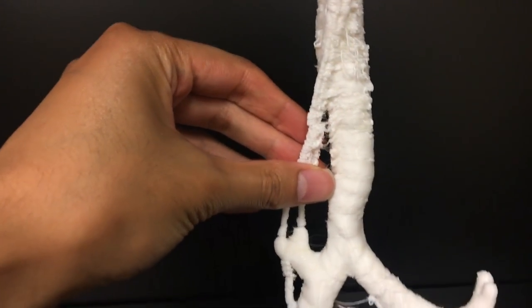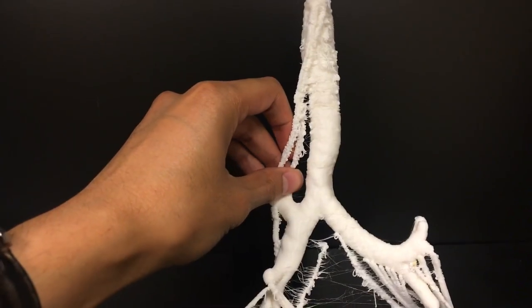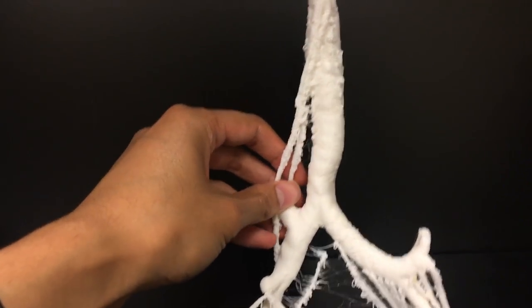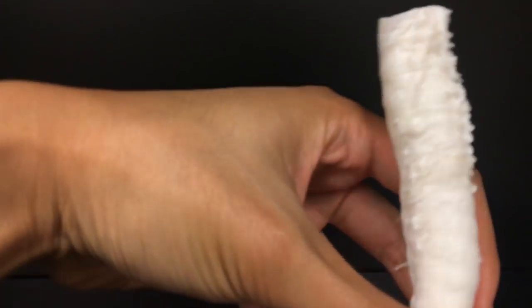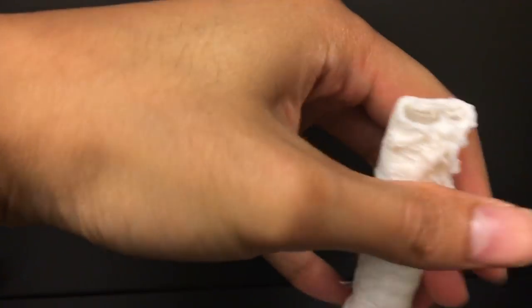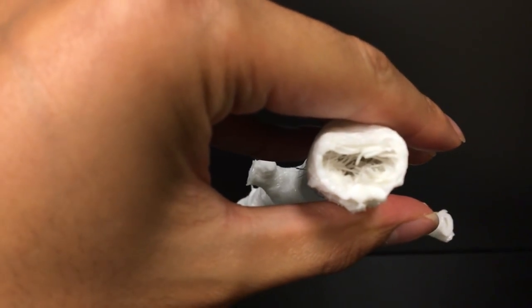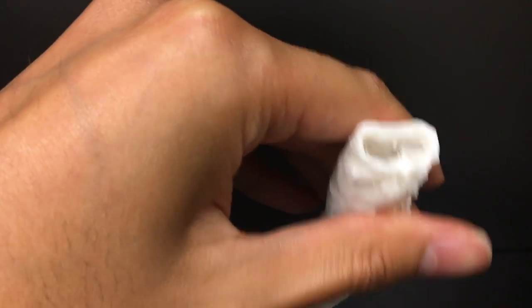So the next step would be to clean up the model, basically. Just take off your supports. And once you do that, it looks like this. There it is, fully cleaned. So again, the geometry up here, not spectacular. I would try and fix that. What I've had to do actually is cut off just a tiny, tiny portion of the opening to the trachea.